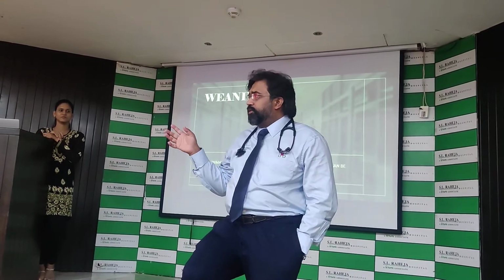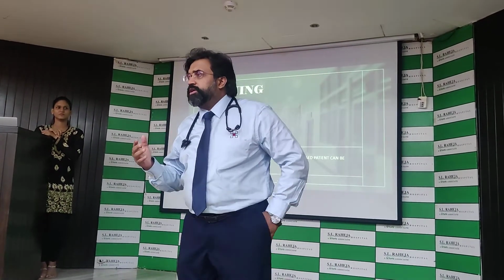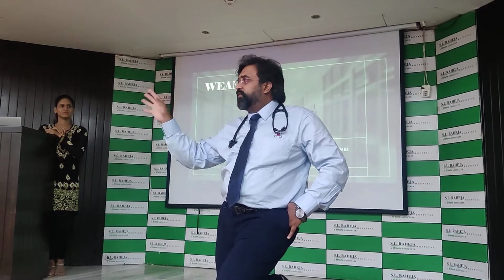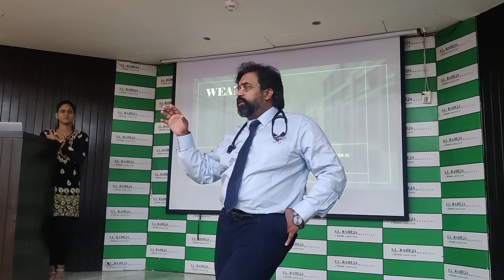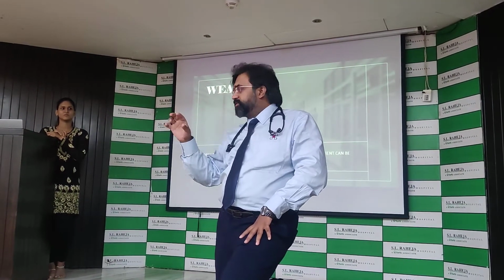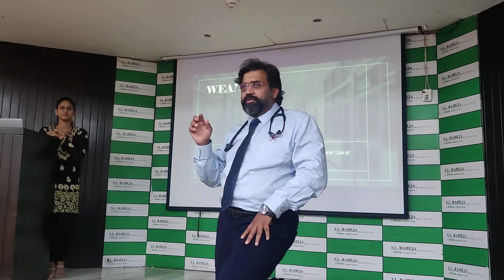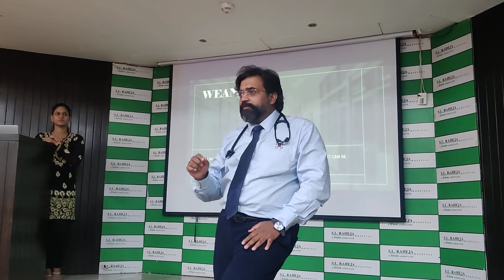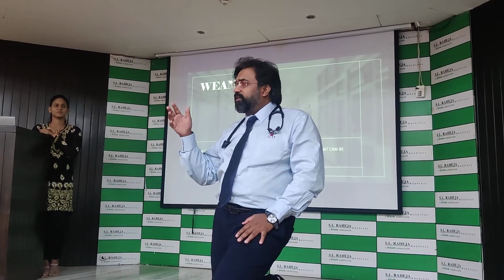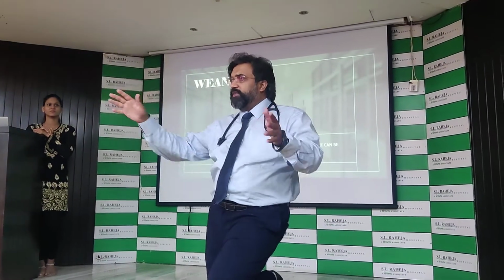So in this ventilator, say this patient has come in, for example the patient on top who is on ASV now. We put it on 120%, or 130%, and then we leave it, forget it. Now there is a white box where you will see whether all the parameters are in the right place, whether the plus is right inside the box that we talked about. You will look at that, and if it is in that place, you are comfortable that everything is looking well.